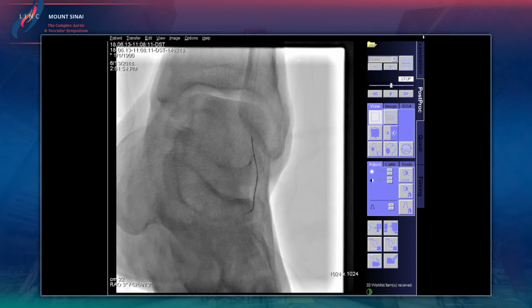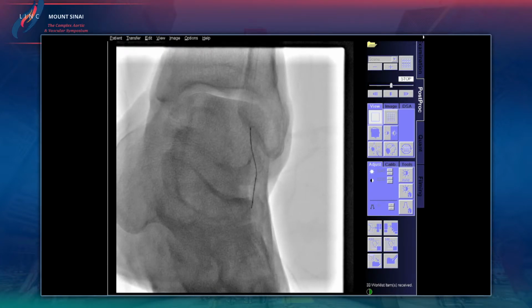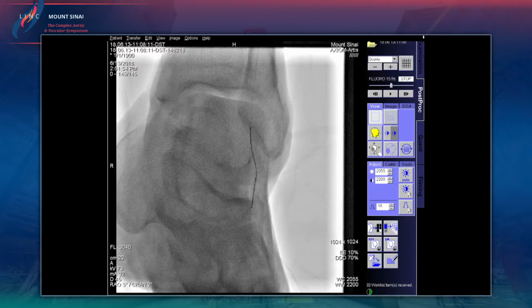it depends if atherectomy is reimbursed, so this is not homogeneous in Europe. But anyway, at our institution, we would do atherectomy and then we will use DCB because you see that the drug-eluting stents are open, so I think drug might work in this patient, and we would use a DCB, and if we have an issue with dissections, we would maybe do this so-called spot stenting, and you can say you go for this philosophy of just use the bare metal stent after DCB usage. Or the TAC. TAC.